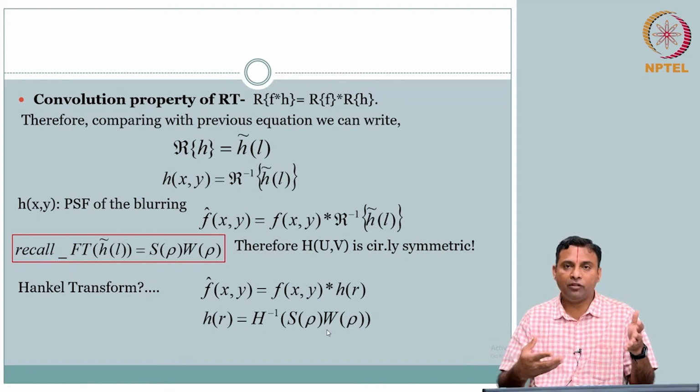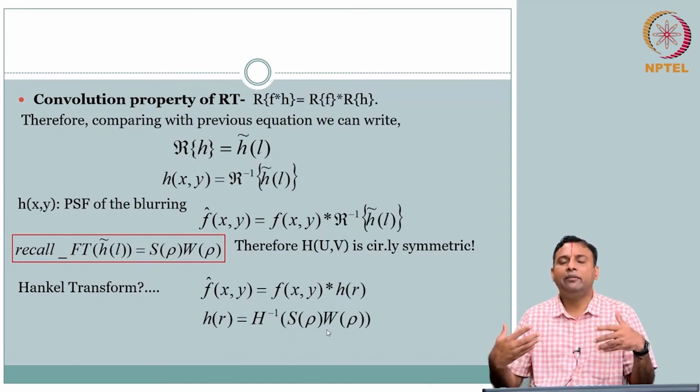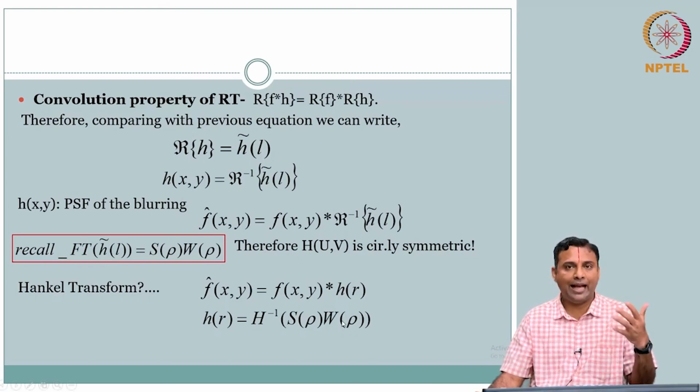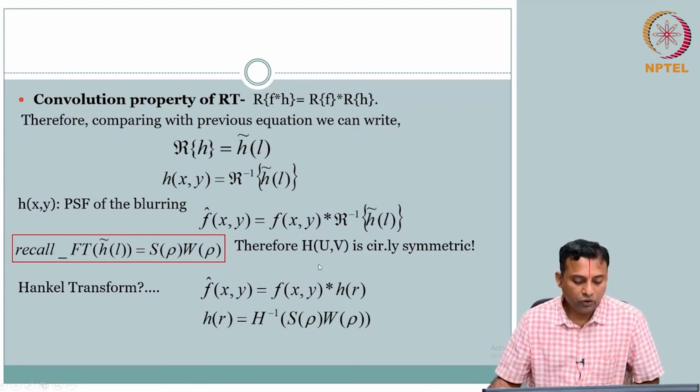In any of the examples, like Lena, you can take any image data and play with this blurring function. You can see the effect when you change the window size, window shape, Hamming, Shepp-Logan, whatever, or detector function. You can give it some point spread value and see what's happening. Okay, good. So much for resolution.